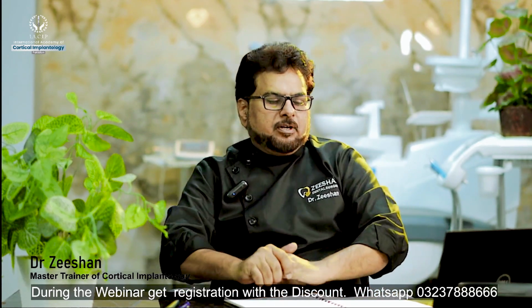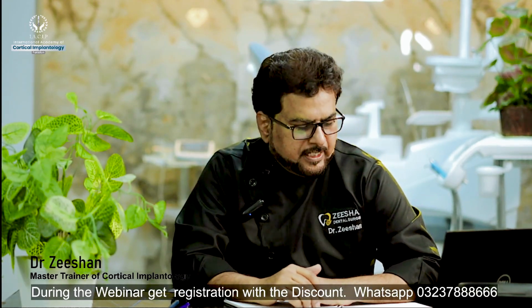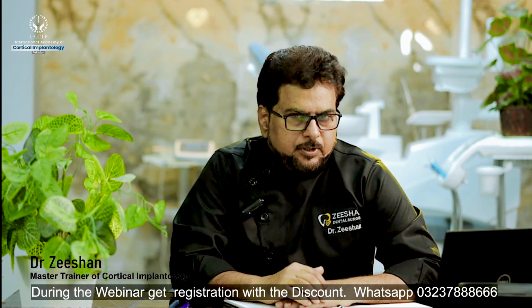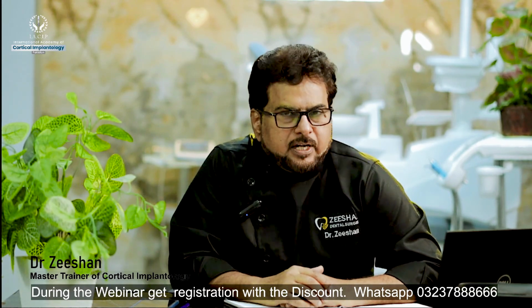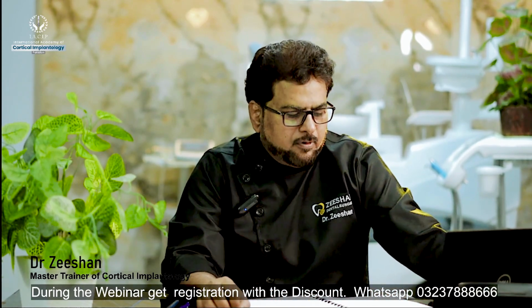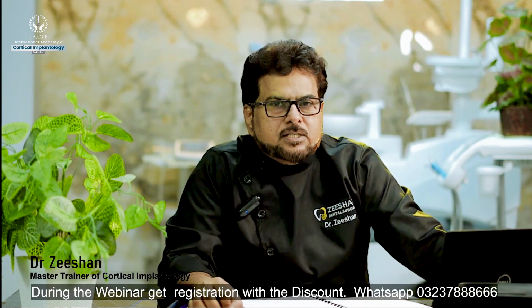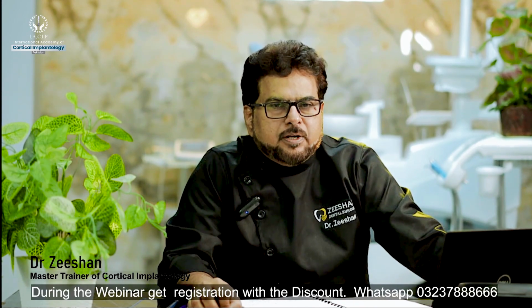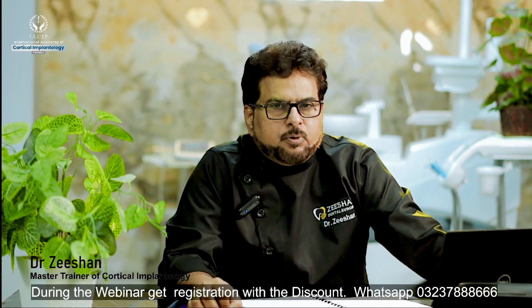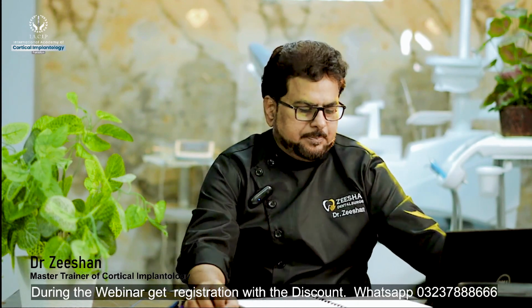A dental implant placed in basal bone can be immediately loaded with teeth, as this bone is very strong and never gets resorbed throughout life, and forms the stress bearing part of our skeleton because of its highly mineralized surface. This provides us the basis for immediate loading.